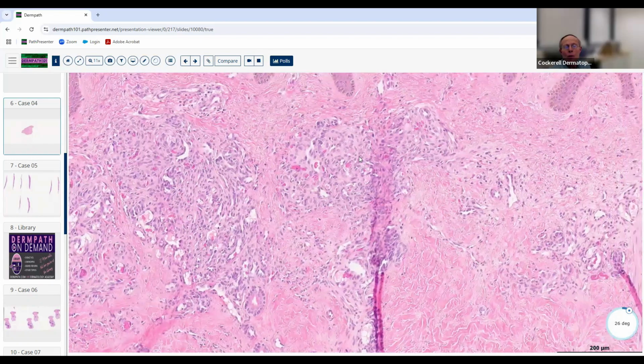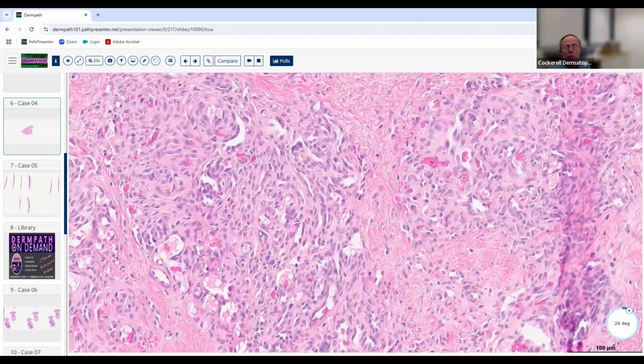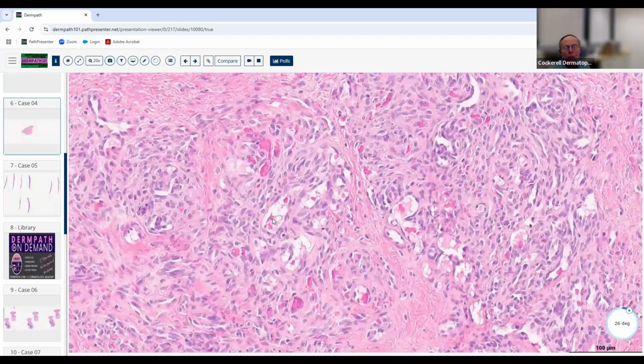And then you can also get angiosarcomas with different histologic morphology. Sometimes the cells can be very large and they can look like a carcinoma, for example, a so-called epithelioid angiosarcoma. So in those cases, you want to make sure that you work it up with appropriate staining to prove that it is a vascular lesion as opposed to an epithelial lesion, because the prognosis is way worse for this than it is for a squamous cell carcinoma.